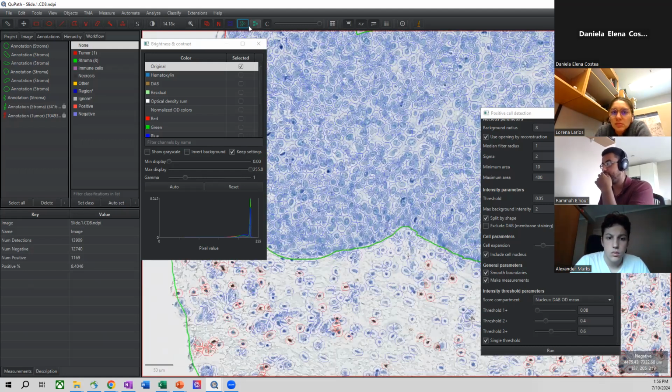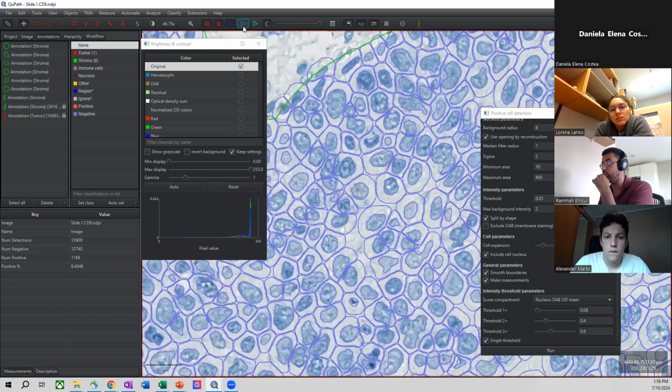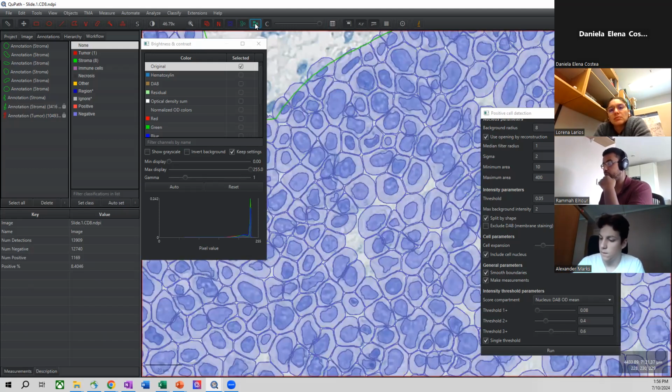This is useful when he modifies this, definitely. Otherwise it gets very messy if you look at it like this. So it's useful, as Dara mentioned, to be able to toggle on and off to see if it looks correct or not for you. And you can also fill them in like that with this button here.